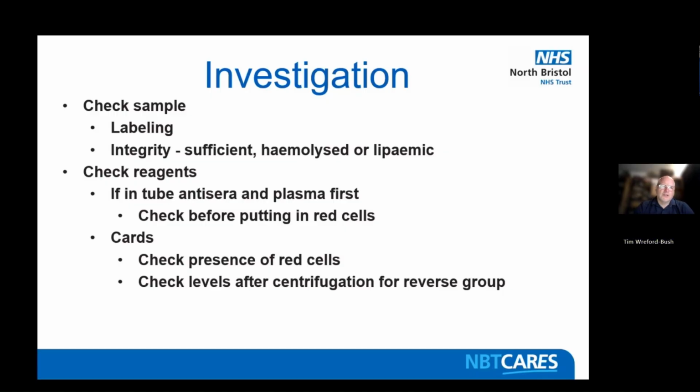Cards: check the presence of red cells. It sounds simple. I mean, don't forget the simple stuff is really one of the things I want to drum home today. Don't go diving into the air and the mystical side of things of transfusion. Start with the basics, start with the little stuff. So check the red cells are in there.